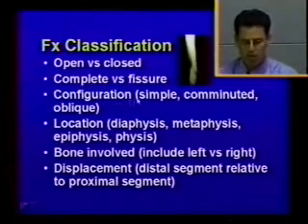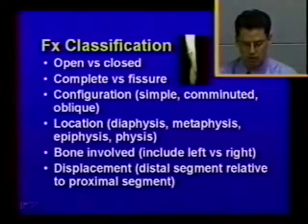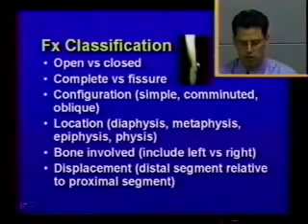Then we'll comment on the configuration, whether it's simple, just two fracture fragments, this portion and the lower portion, or whether it's comminuted, and there are many fracture fragments at the fracture site. And then also whether it's oblique, a short oblique, such as this fracture, or whether it's straight across, which would be termed transverse.